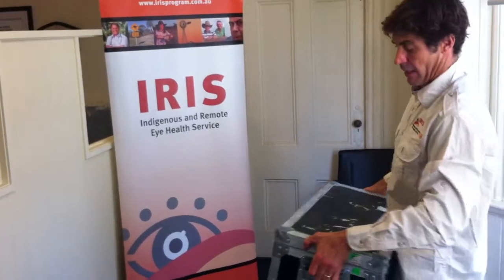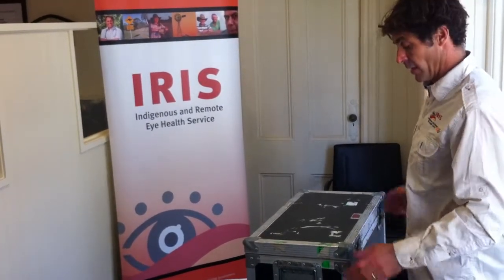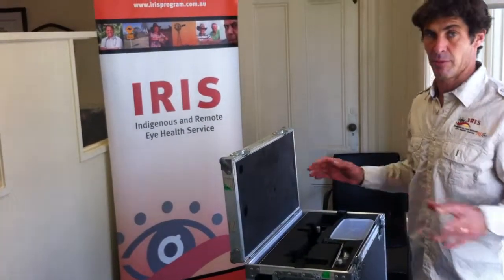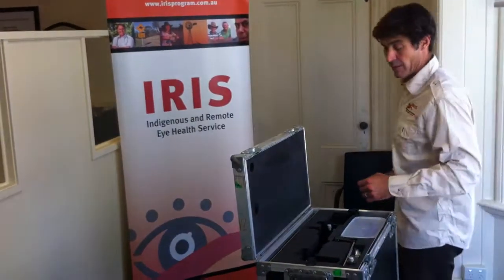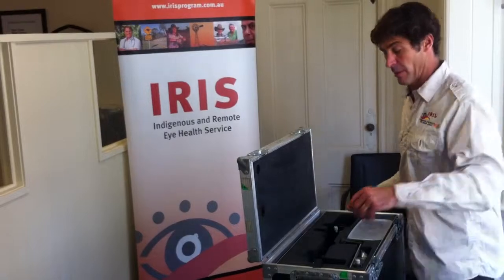We've got this slit lamp here. We took it off the table and put tables in all the communities that we work out of — there are 26 tables. This has since been expanded around Australia via IRIS, and I think we have an excess of 70 tables now around Australia.